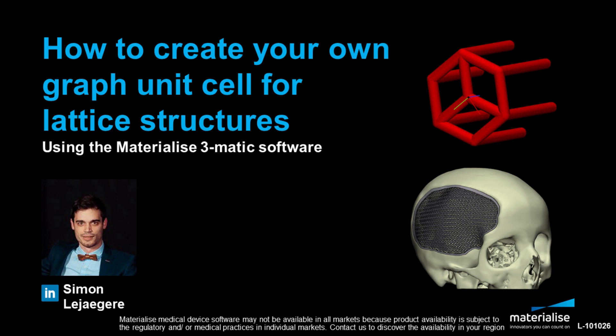Hello, my name is Simon and I'm a medical application engineer at Materialize. In this video, I will show you how to create your own graph unit cell for lattice structures using the Materialize 3Matic software.